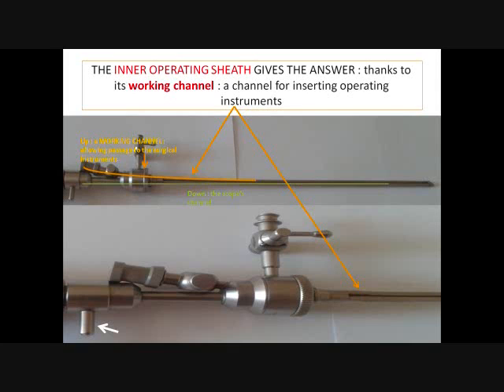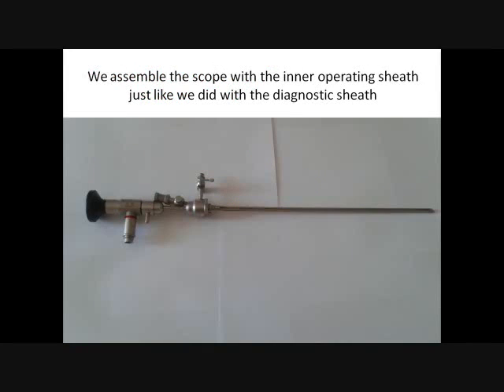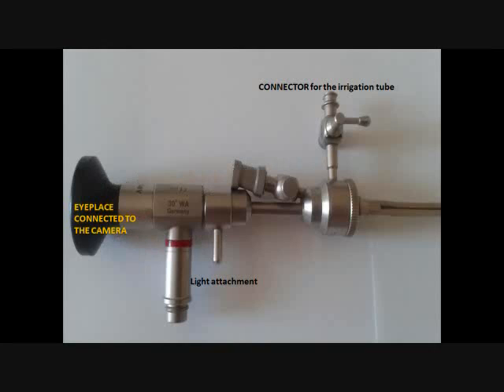It has, see, down, the sheath for the scope. And up, you see a working channel. It's a channel that allows inserting semi-rigid operating instruments inside the uterus. And the white arrow indicates the screw, which, just like the diagnostic sheath, helps lock the scope so that it doesn't move. And so we insert the scope inside the inner operating sheath, exactly like we did with the diagnostic sheath. It's the same technique. And we assemble them together exactly like we did with the diagnostic sheath.